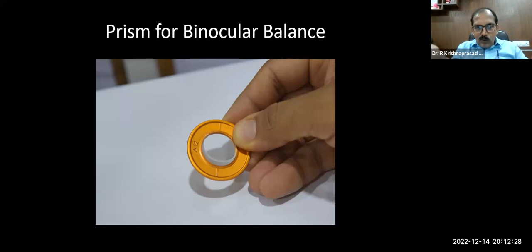And here also, you need to fog the patient. Okay, like -2 right eye, -3 left eye, you put a fog of +1, then put a vertical prism. Then you will have two charts, one for the right eye, one for the left eye. Compare the two and both should be equally blurred or equally clear. If there's a difference, he's reading 6/12 in one and he's reading 6/60 in the other, then there's an unequal accommodation. Then you need to find out what has gone wrong.